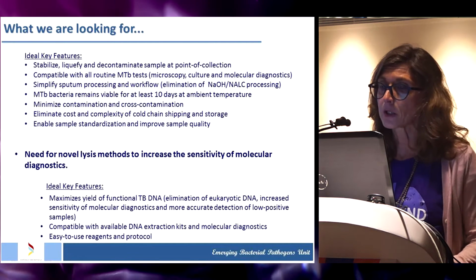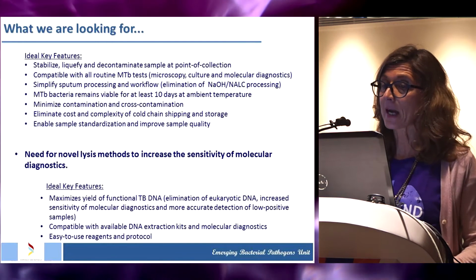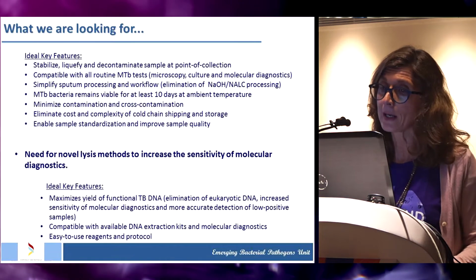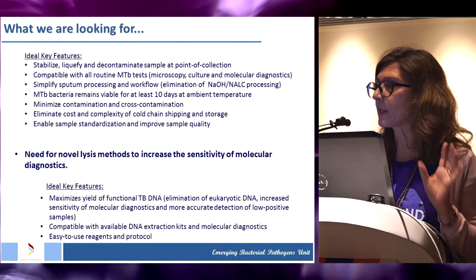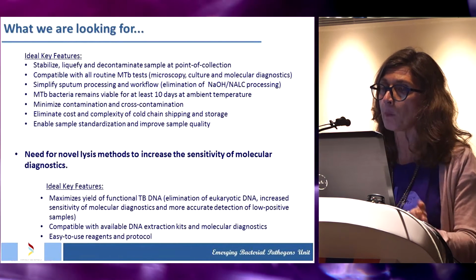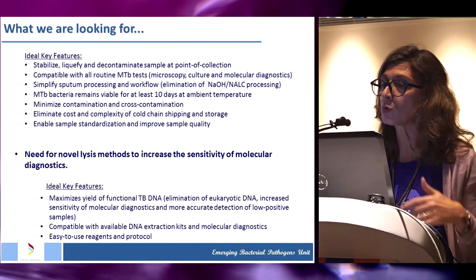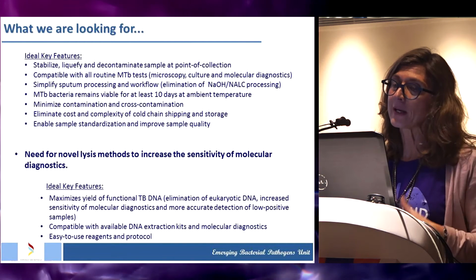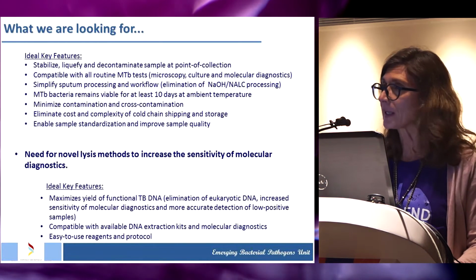So at the end, I'm concluding here because we are looking for something that is stabilizing, liquefying, and decontaminating our sputum sample at the point of collection, that is compatible with the existing and future TB tests and that can simplify the process. So I can explain to the country, when I give the survey protocol, that it is only a simple laboratory procedure, and then they can keep the samples and avoid shipping every 3 or 4 days. And that will also eliminate the cost and complexity of the cold chain shipment. And so, I'll thank you all.